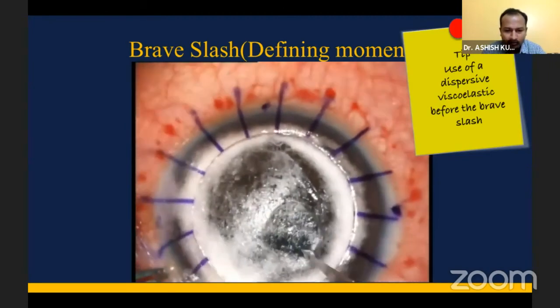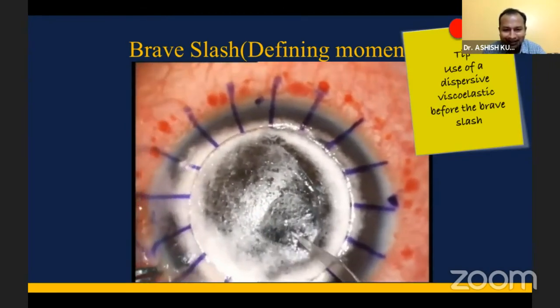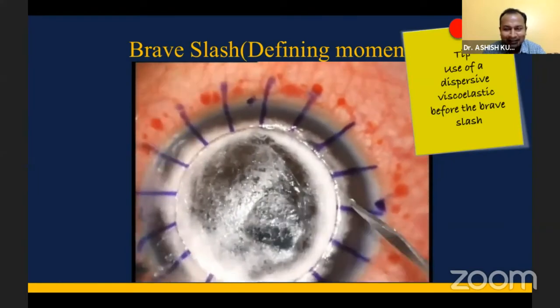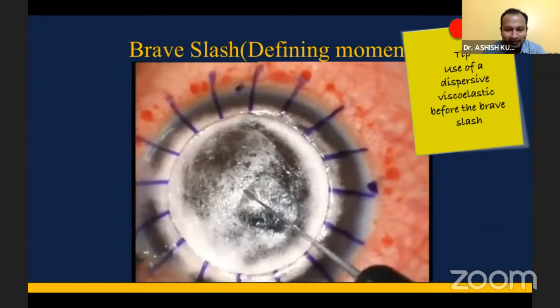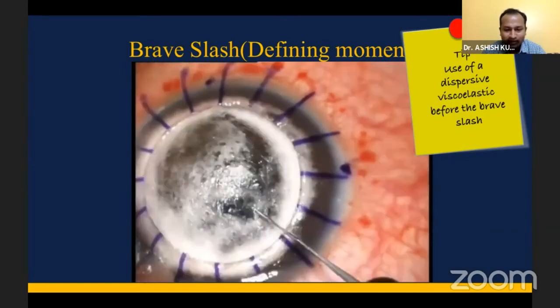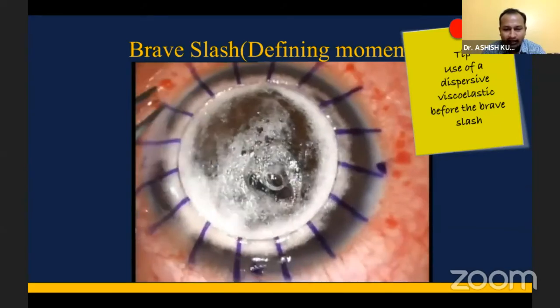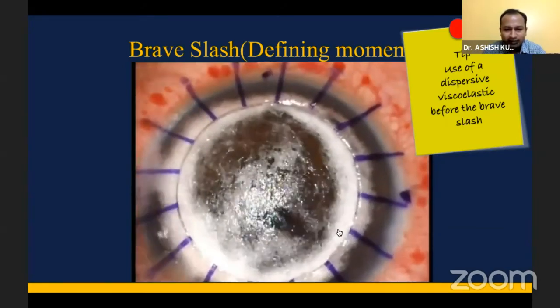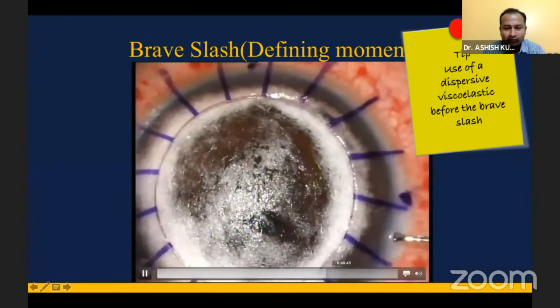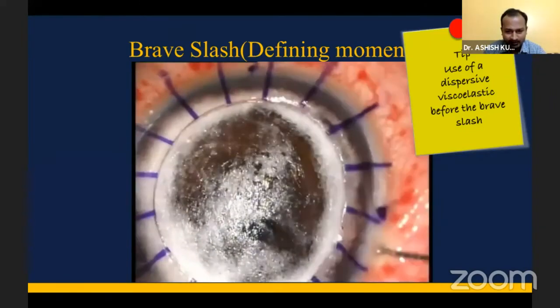So now I'm trying to attempt that slash. I'm not that brave. So small, gentle, repeated movements, and there you go. So you have the bubble escaped, and then again decompress the chamber. So always, always keep decompressing the chamber at every step.